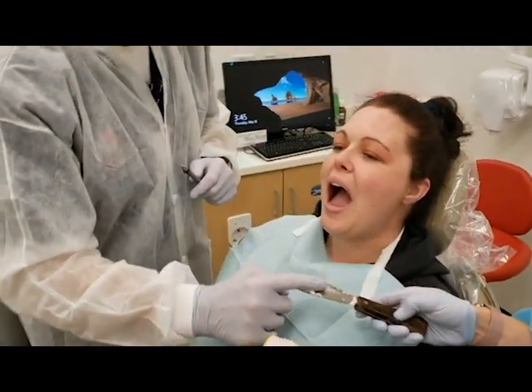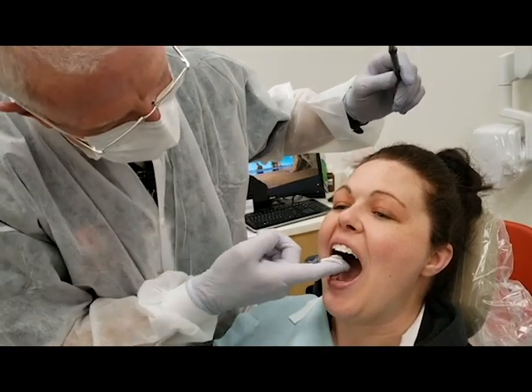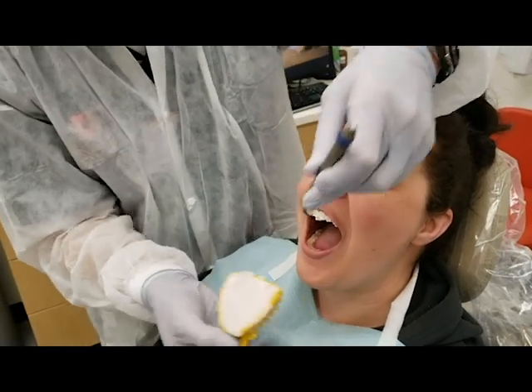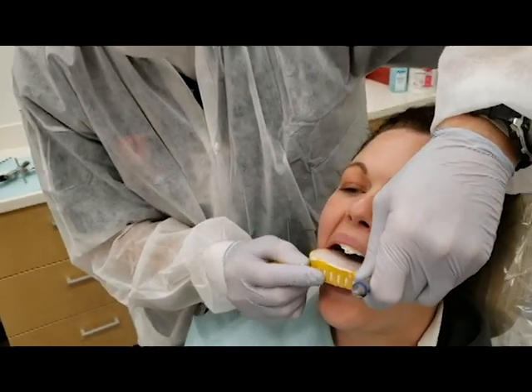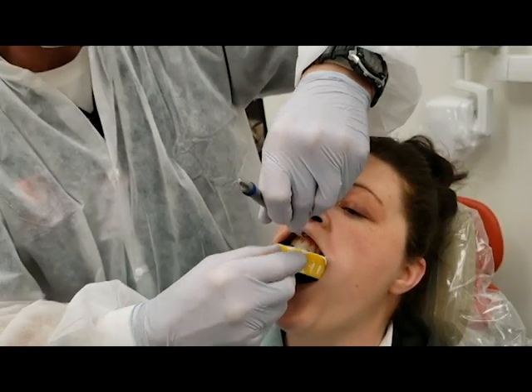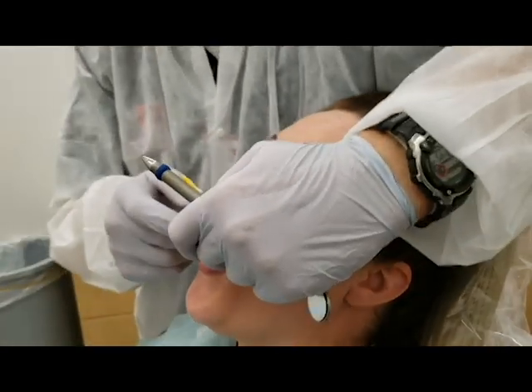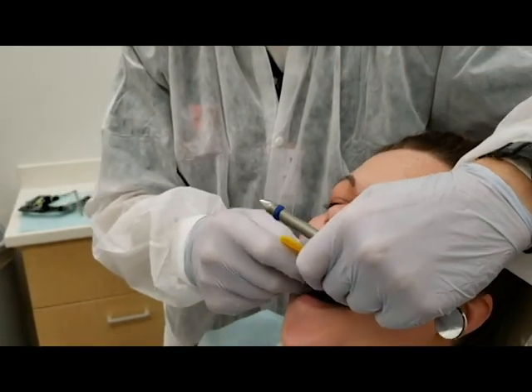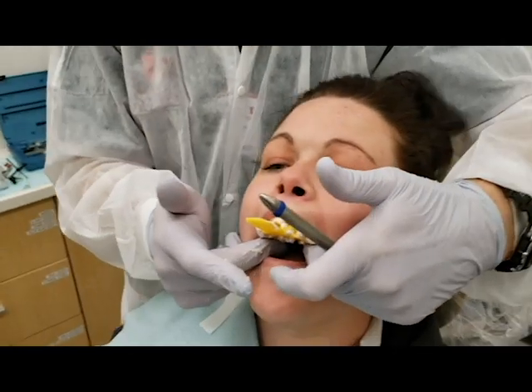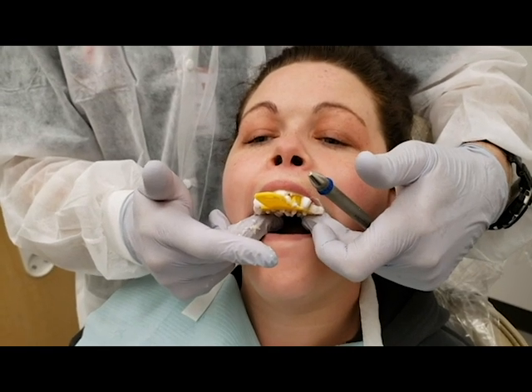I can't take an impression without a mouth mirror — it is invaluable to have to retract with. The mouth mirror comes on the left side, the tray is rotated into place, the mirror comes to the front. See how far forward that tray is, so that when you insert, you shovel or scoop all that excess material up underneath the front lip like that.